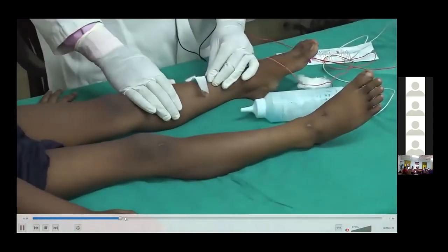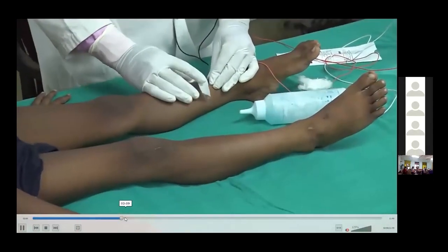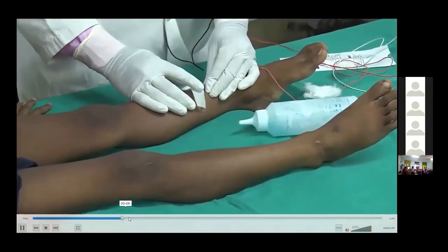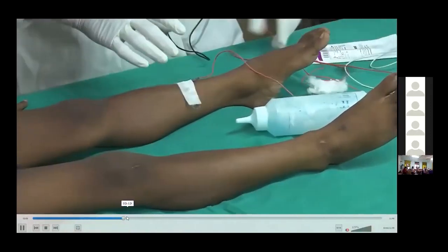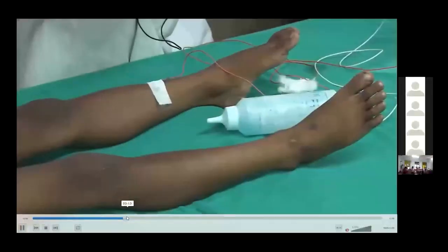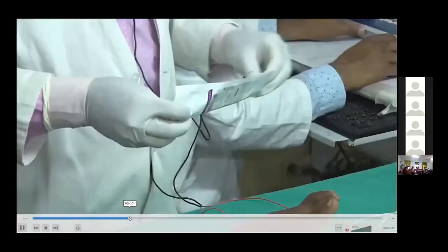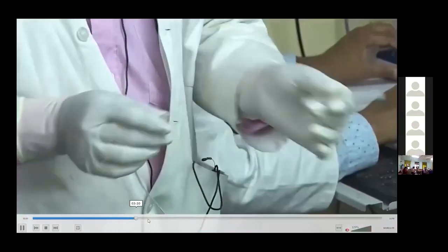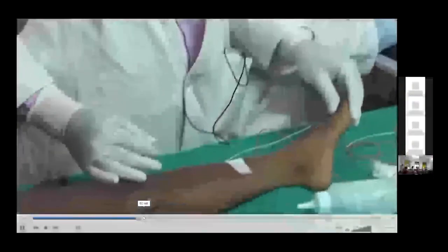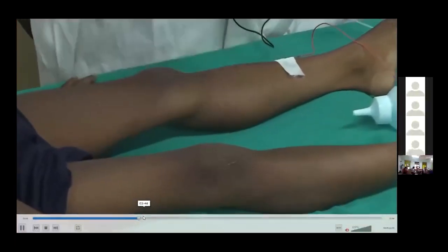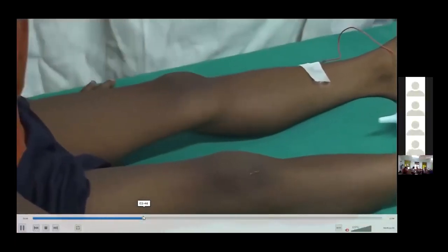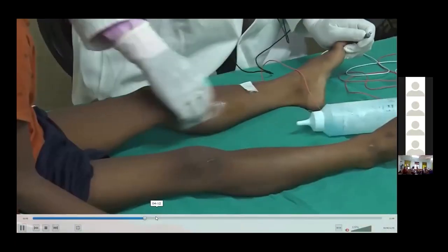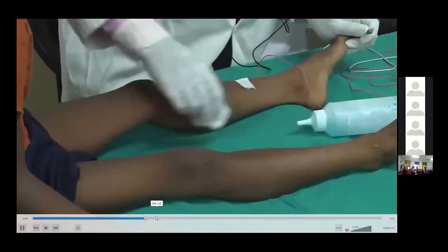The grounding has been fixed. The tibialis anterior muscle is being sampled. The child has been explained regarding the procedure. You see the needle. It has been cleaned.